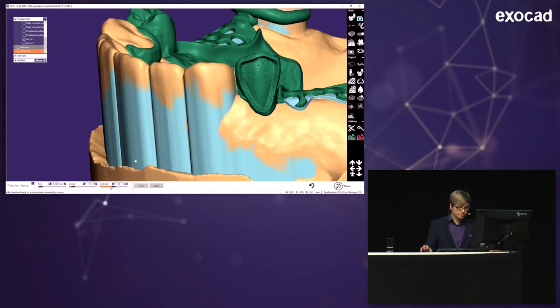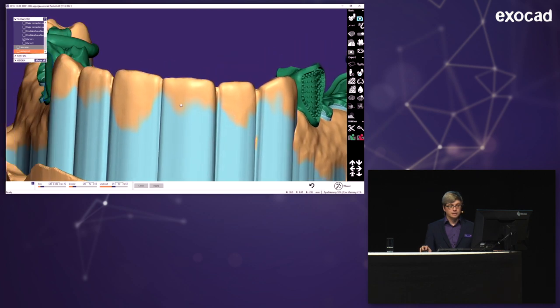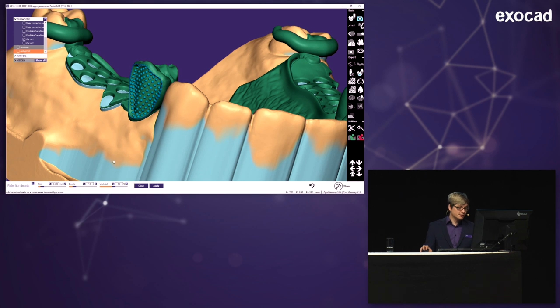Those are a little bit small, to be honest. Don't know why I did it like that. But let's make them a little bit bigger and a little bit more. OK, that's maybe a bit too much. But now you have retention beads there, and you can add any kind of veneering, acrylic, or whatever you want to use. Maybe not ceramics.